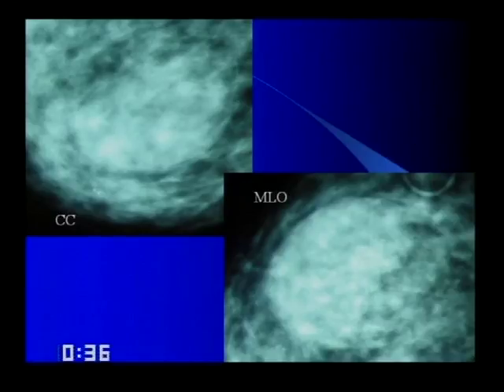And why do you say hamartoma? Well, it's heterogeneous in appearance, and part of the mass looks like the texture or fibroglandular density is similar to breast parenchyma. And what do you need for hamartoma? What density? Fat. Okay, as well. Is there fat in it? Well, I think maybe deep. Okay. There could be some. So what are you going to do next? I would do an ultrasound.